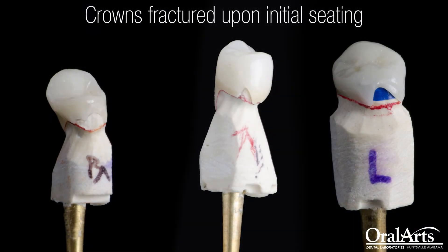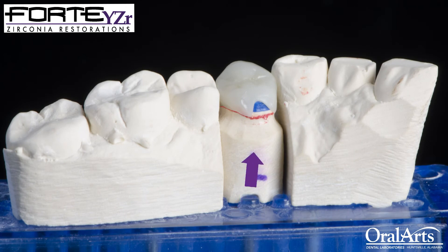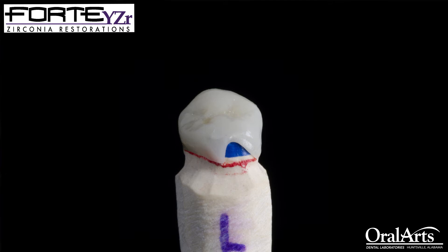In these images, you will see actual cases that have come back from our clients that have needed to be remade because of a fracture. What I want you to notice on this Forte crown is that the fracture is at the margin. These margins are feather-edged with absolutely zero chamfer, and they're usually opposing the functioning cusp of the restoration. I'm assuming that when these doctors are placing these restorations and the patient goes to bite down to check the occlusion, they have a pop at the margin.